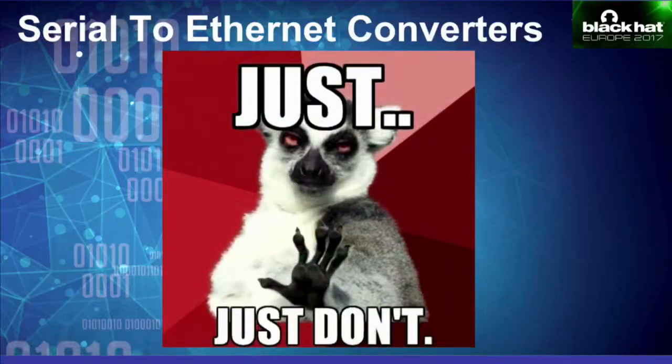Like I just mentioned, a lot of these devices, which are older, like your ECG machines and your MRI machines, are now connected to the network. Since they are legacy devices, they were never meant to be connected to the network, and the way they are connected is using a hardware called a serial to Ethernet converter.